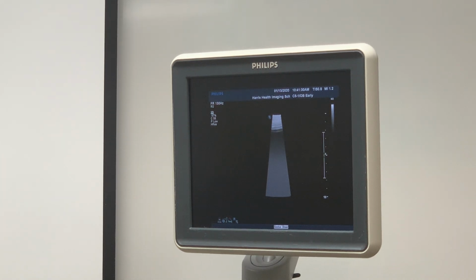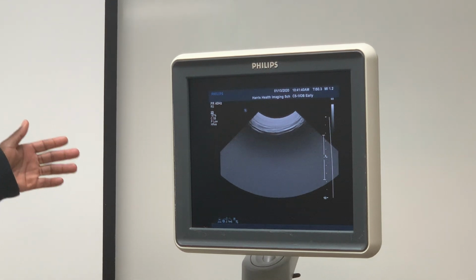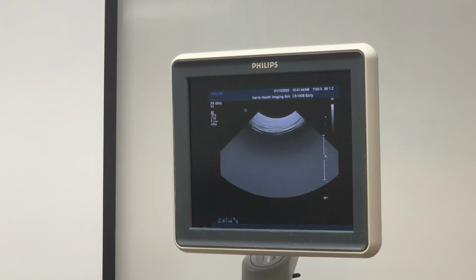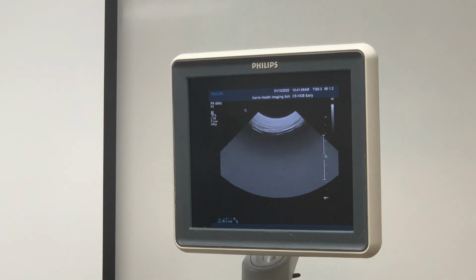Can we use it as a wider scan too? Yeah, if you're using wide scan, then you're increasing the number of scan lines. So there's my regular screen. I hit wide scan in the opposite way. Now it's adding more scan lines to this one image, decreasing my temporal resolution because now I'm adding scan lines to the image. Like more pulses, right? More pulses, absolutely.